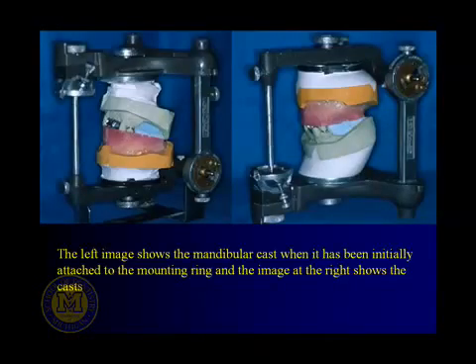So if you have one of these, quote, old-fashioned articulators, these were the new ones when I was in school. Actually, this is one generation past when I was in school. So anyway, if you've got to mount a lower cast, back in the lab is going to be one of these little things that will allow the articulator to stand on its head very nicely. Mount the lower cast, smooth them up and make them look pretty. Okay? And now you're all set to start setting teeth.